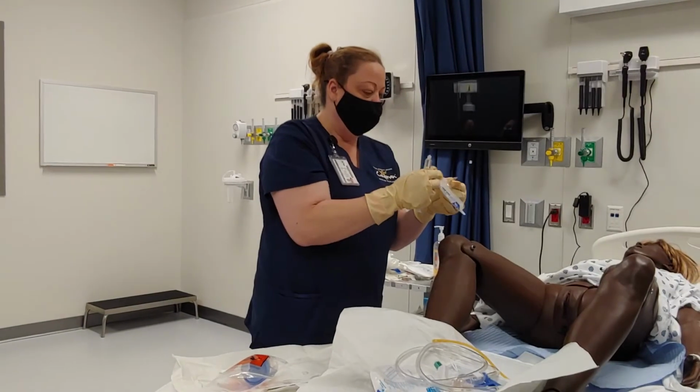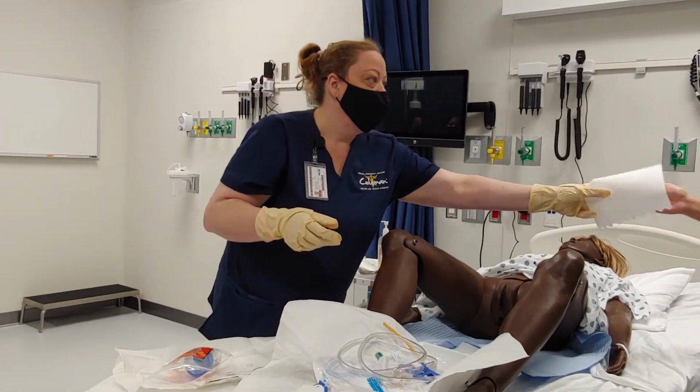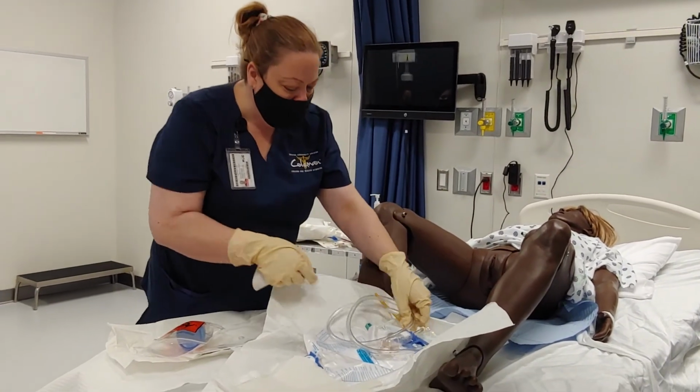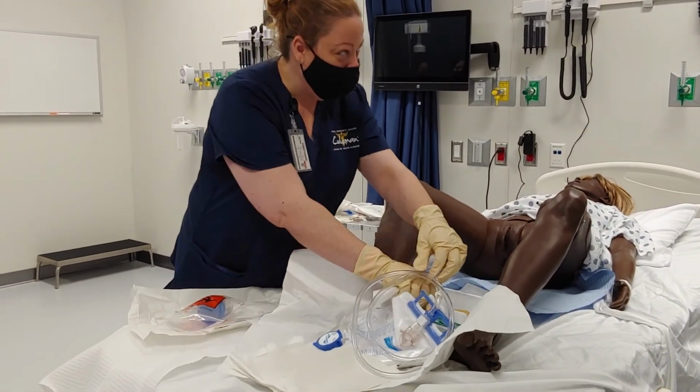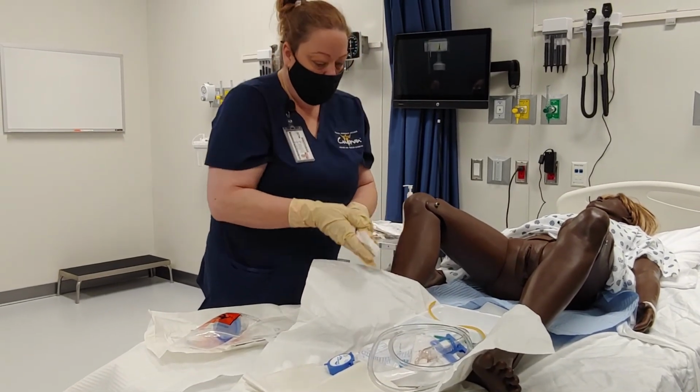Can you give me a paper towel? Do they feel whenever we blow up the balloon? Oh, yeah. They can. When you give it that first little tug, they'll feel that, yeah. But not usually after that.